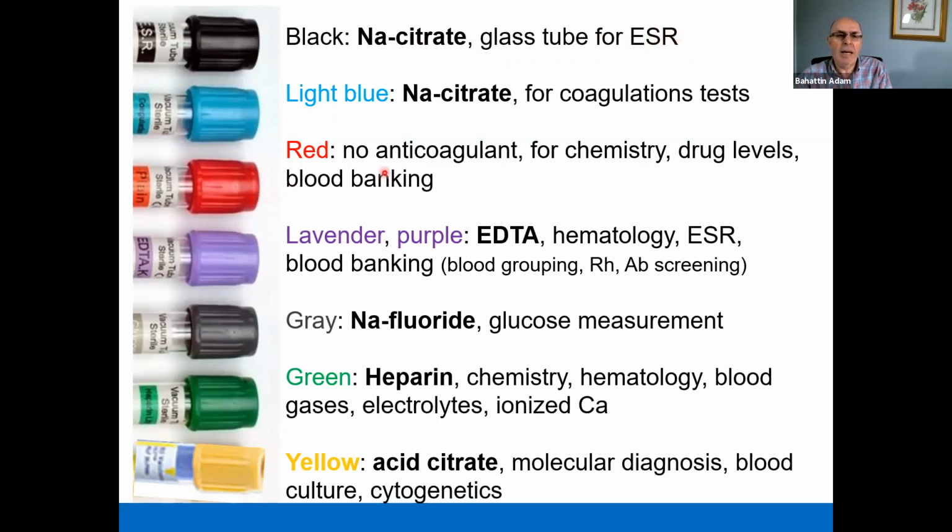The tube with the light blue stopper includes sodium citrate for coagulation tests. The rest of the tubes are plastic.